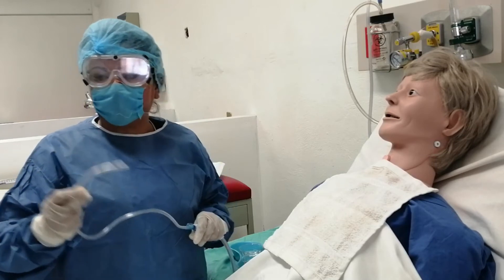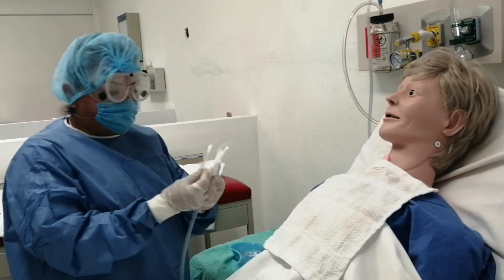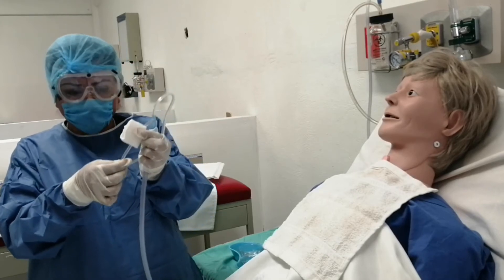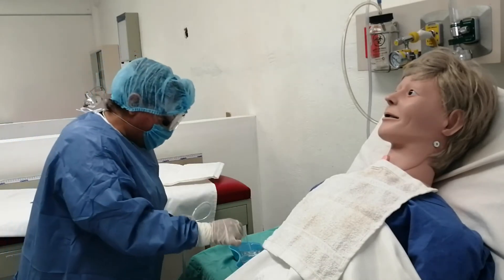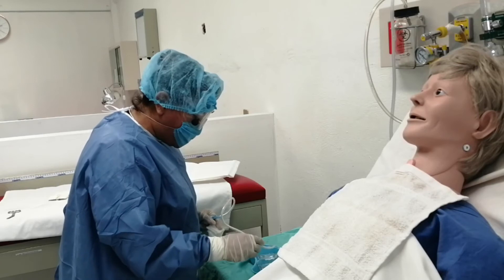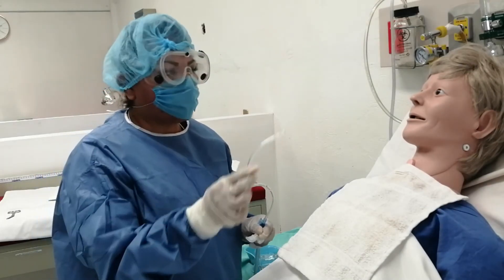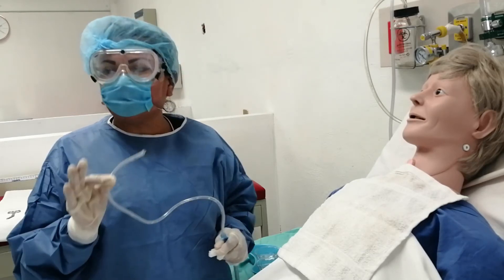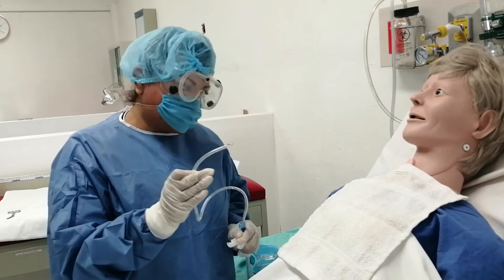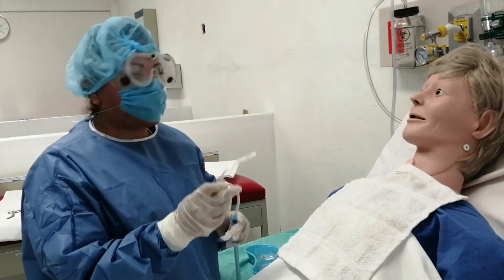Nos detenemos cuando el paciente tenga el reflejo tusígeno, es decir, cuando empiece a toser. Sacada la sonda de la cavidad, procedemos a limpiar desde los 12 a 13 centímetros hacia el inicio, limpiamos y enjuagamos la sonda metiéndola en la solución para que aspire y permeabilizarla. Repetimos el procedimiento en esa narina las veces necesarias, siempre permitiendo que el paciente recupere su respiración o colocando oxígeno si lo tiene como tratamiento. Limpia la narina distal, procedemos a la narina próxima.